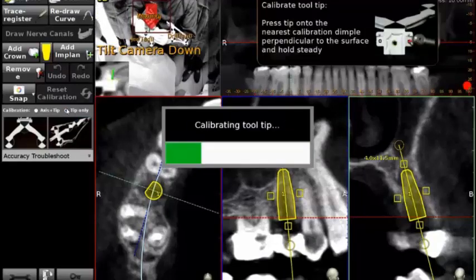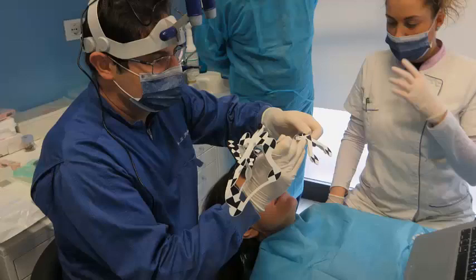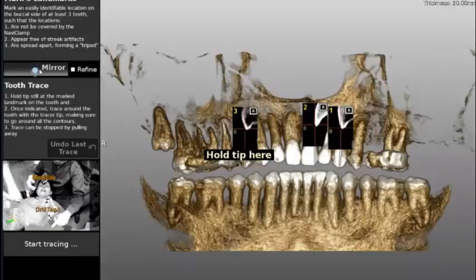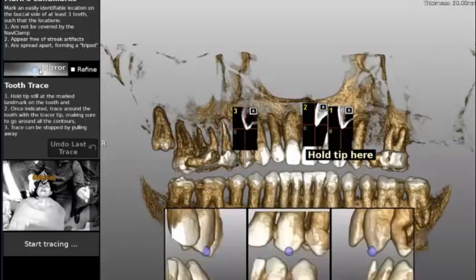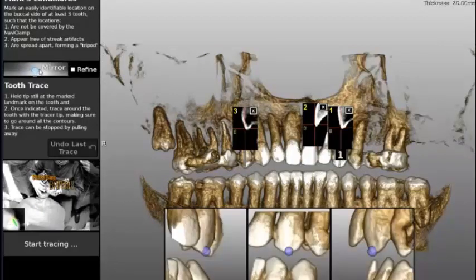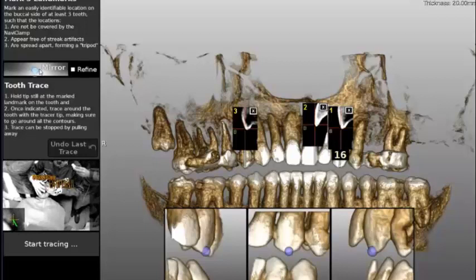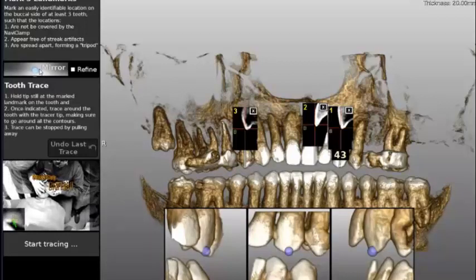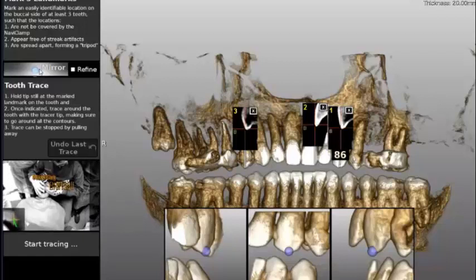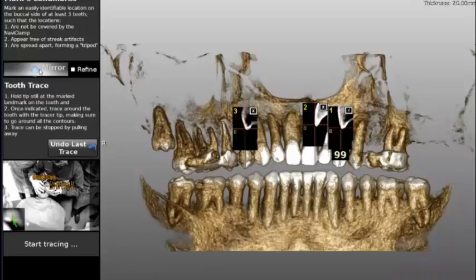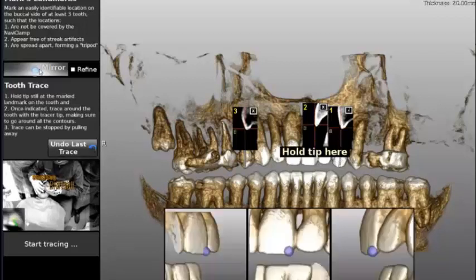The protocol starts with the calibration of the tip of the tracer. After that, the tracer is pointed to three teeth. For each individual tooth, the surgeon needs to cover a surface of 100 points. We start with the first tooth, then moving on to the second tooth.